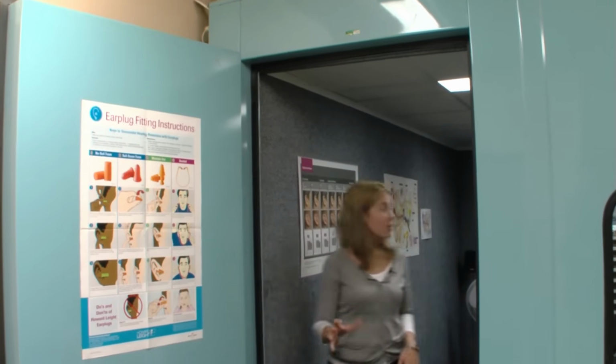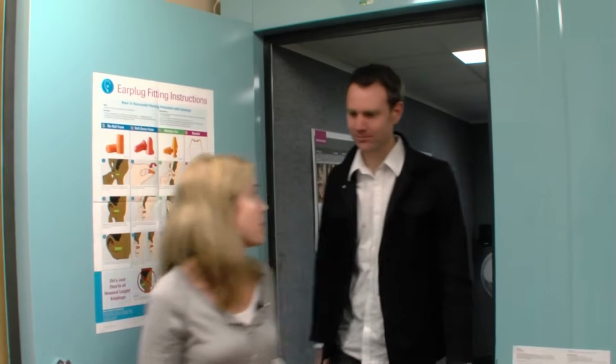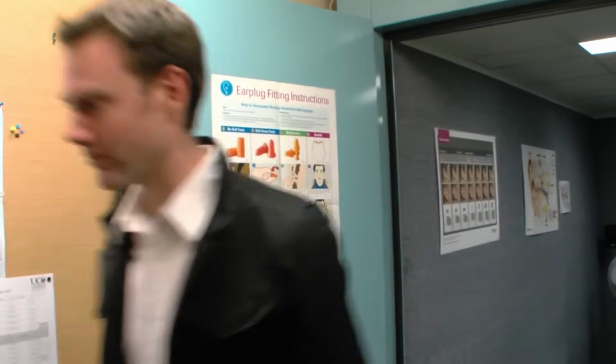Looking at these low into the mid pitches here, your hearing's looking absolutely fine. What's happening is as we get into these higher pitches, it's sloping off down to a more mild through to a moderate hearing loss, just at the very highest pitch there. A formal report is usually prepared and sent to the client, as well as to other relevant health professionals. What I'll do is write out a full letter with a copy of the results and send them out to you in the mail. Right. Okay.